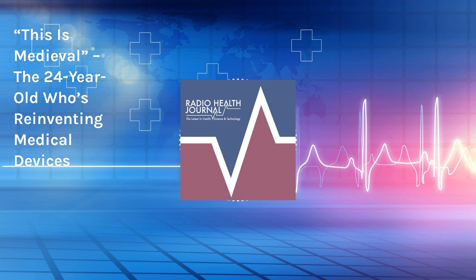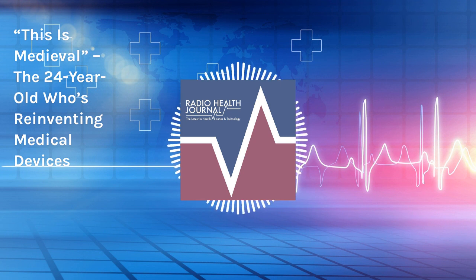Oftentimes, this is done in an emergency. These are patients who are rapidly declining, where we want to treat them as fast as possible. And so oftentimes this is not done in the operating room, but it's done in the intensive care unit at the bedside. The process begins by shaving the patient's head to expose the scalp where the drain needs to enter. Potts says it's typically done in the frontal region on the right side of the brain. It's in an area that doesn't control movement, doesn't control sensation, doesn't control language, doesn't control memory. It's probably the safest place we could place a drain or a pressure monitor.